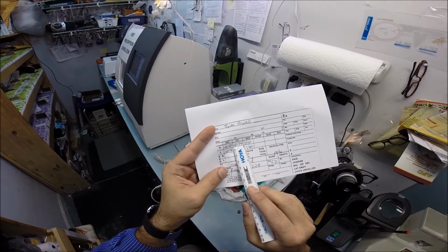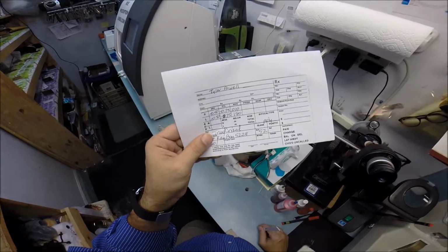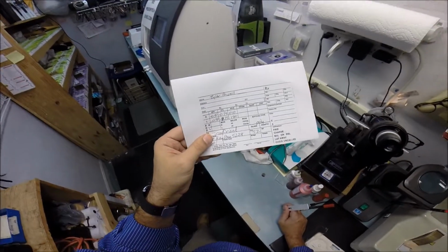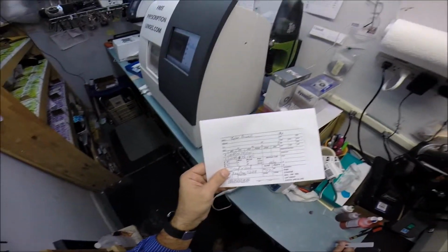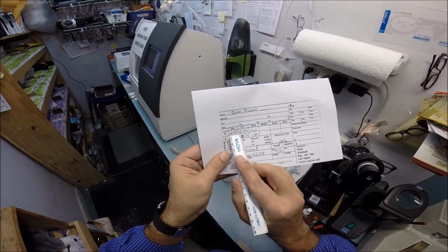Now you have an additional 3 steps of astigmatism correction, and there is a stigma over the word astigmatism. It just means shape. Everyone freaks out when they hear that, but it's just like saying someone has straight hair, someone else has curly hair. It is no big deal. It is not a disease. It is not an affliction. It comes and goes. I don't know why people freak out over that word. But this first number is a real value.